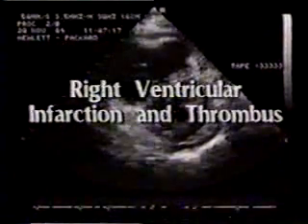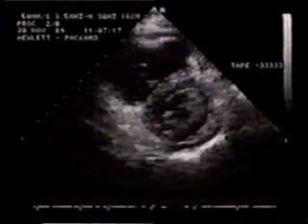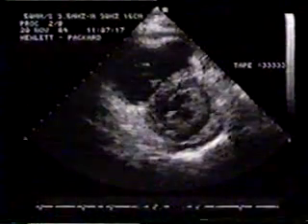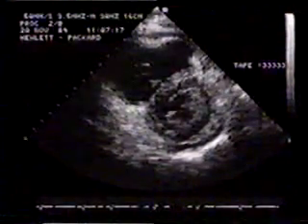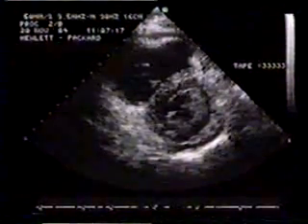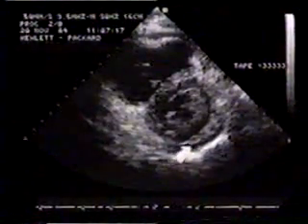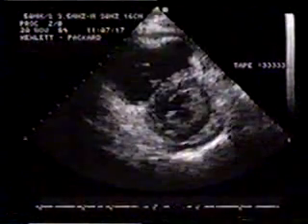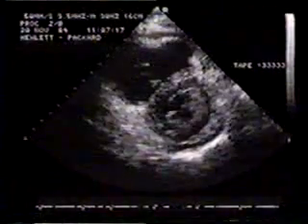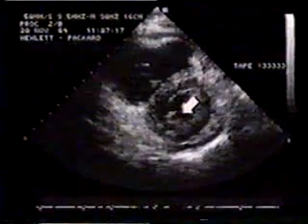This 70-year-old female was admitted to her local hospital with an acute inferior myocardial infarction. She remained stable and was transferred to us several days later for routine post-infarct investigations and rehabilitation. This echo was obtained to assess her degree of left ventricular dysfunction. She has a small pericardial effusion. It is immediately apparent that her right ventricle is enlarged. For the moment, we will focus attention on her left ventricle, which is normal sized.